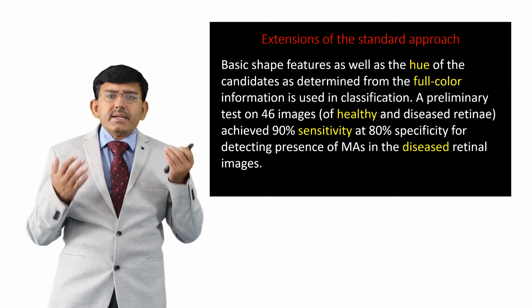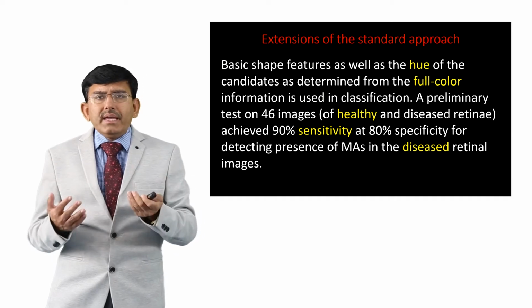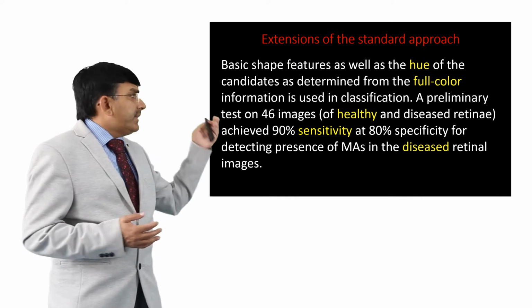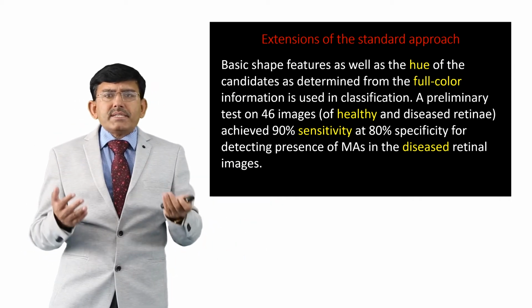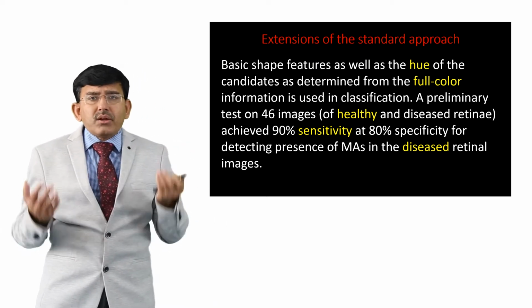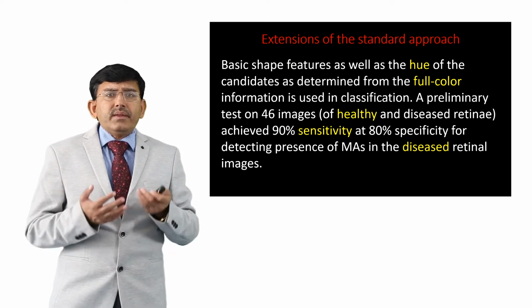A preliminary test on 46 images of healthy and diseased retina achieved around 90% sensitivity at 80% specificity for detecting presence of microaneurysm in the diseased retinal images.